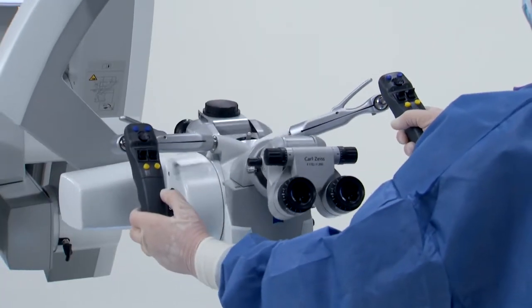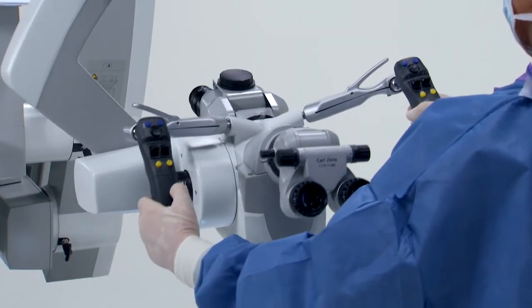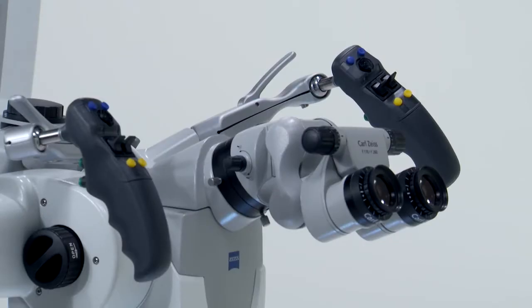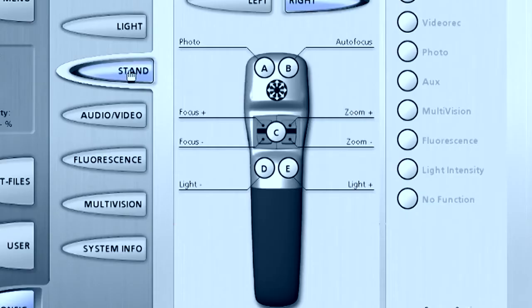The Pentero microscope includes two identical programmable hand grips. Top buttons A and B and bottom buttons D and E can be customized for each user. The joystick in the middle is used for motorized fine movement in the X and Y directions. The joystick is surrounded by rocker switches on either side. The factory settings are programmed for control of the focus adjustment up and down on the left side and for the zoom adjustment up and down on the right side.